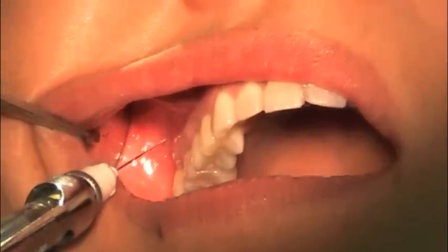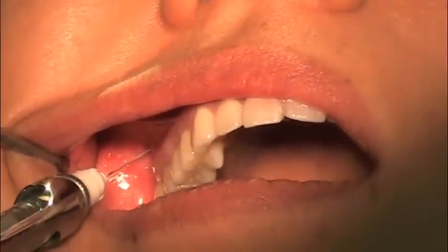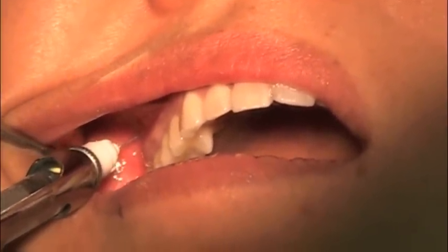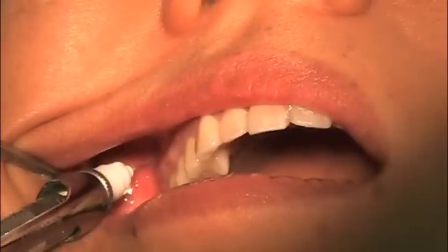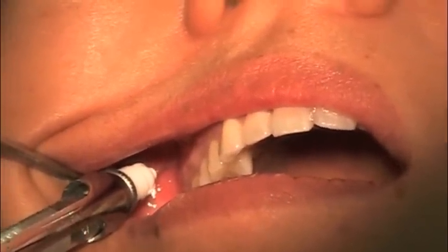Insert the needle at the mucobuccal fold. The needle should be aiming towards the top of the patient's head. Advance the needle slowly about 16 mm. Never insert the needle to the hub. Aspirate 3 times.